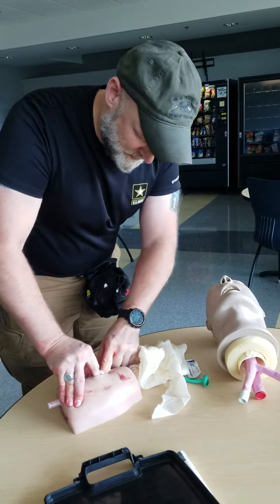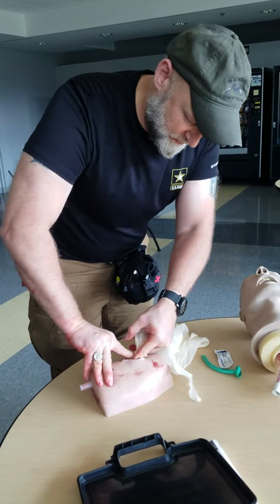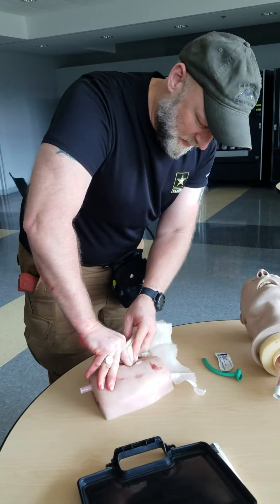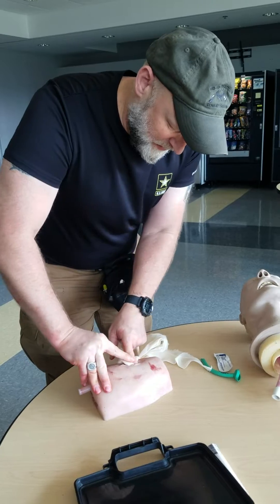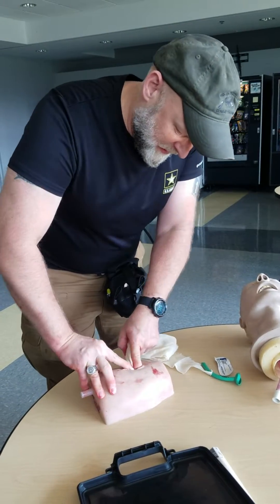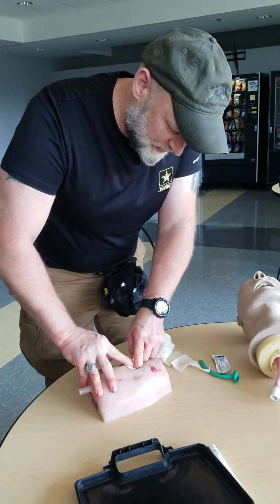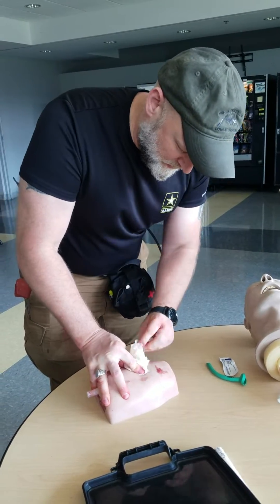Finger over finger towards the heart, keeping direct pressure. If I can't get it all in and there's excess, just keep it on top of it — pull it right there on top.